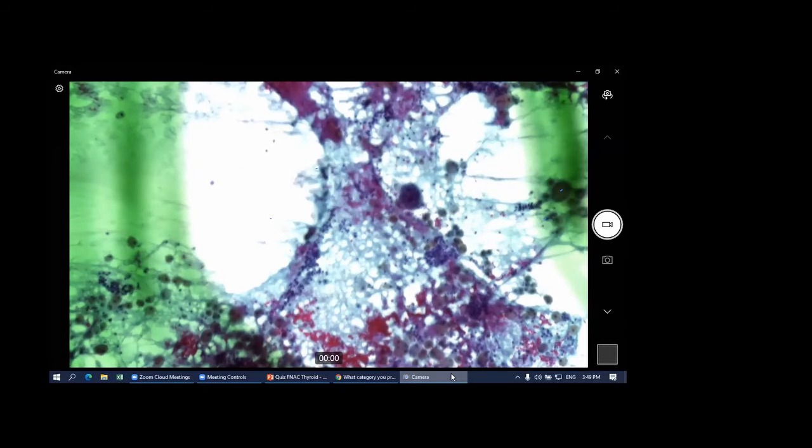Can you see that? It's a bit dark. Okay, now it's okay. This is actually a thyroid follicle. I mean, this is not a giant cell. This is thyroid follicle still, and you can see the benign ones are attracted to the blood, and you can see there's macrophages still there.